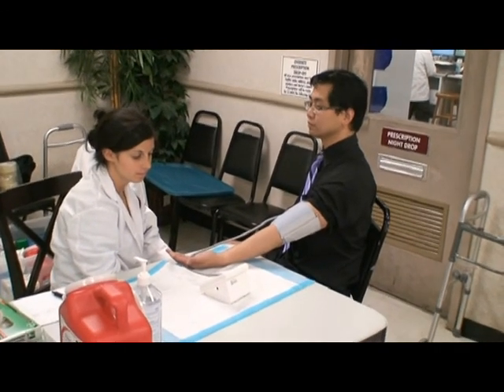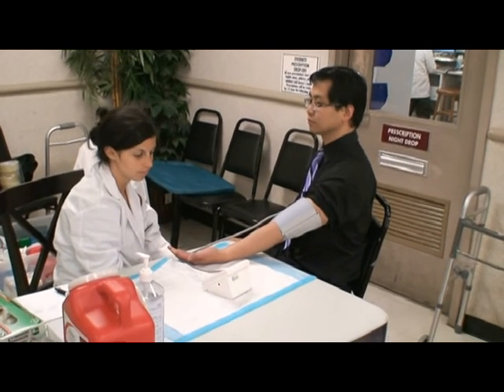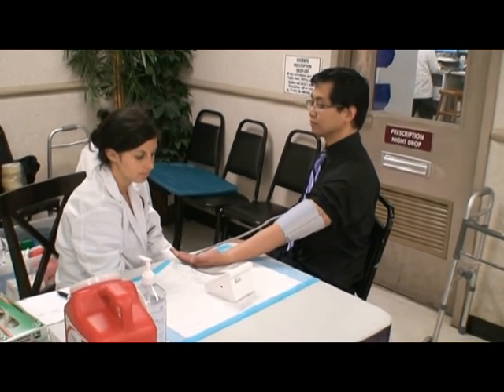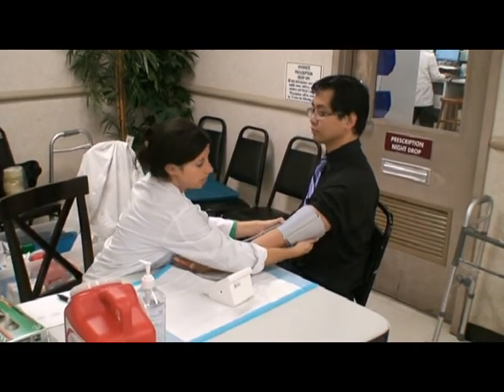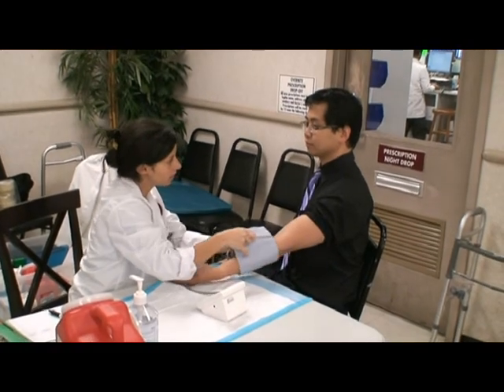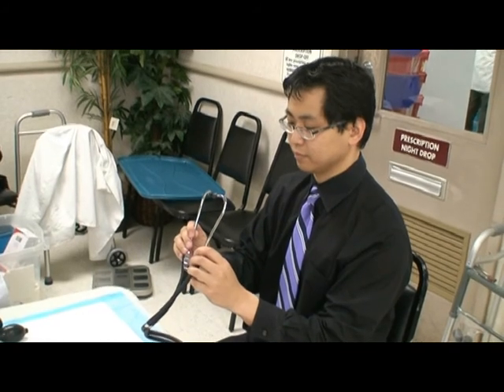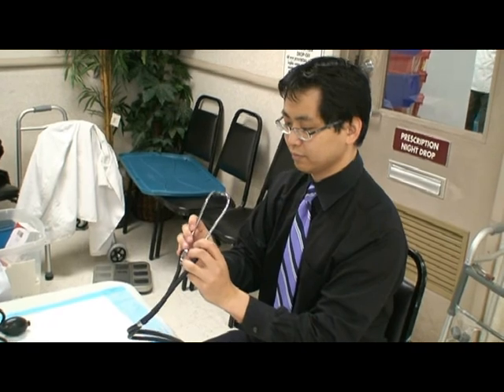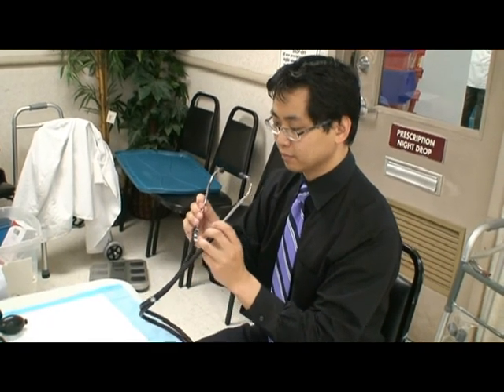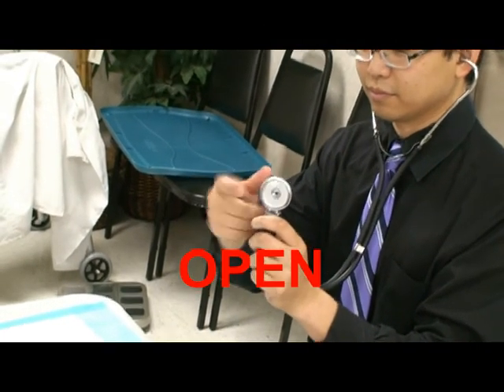If you get an error message or an abnormally high value, we want to retest again with the manual blood pressure. Do you mind if I retest you manually just to make sure that these results are accurate? No, go ahead. We want to have the earpiece pointing towards the nose. Then we will put it on. We also want to make sure that the face of the diaphragm is open.